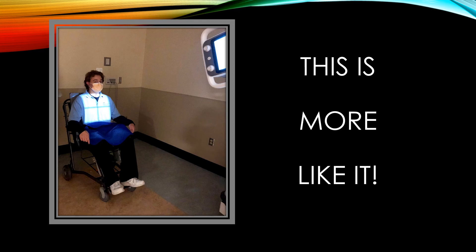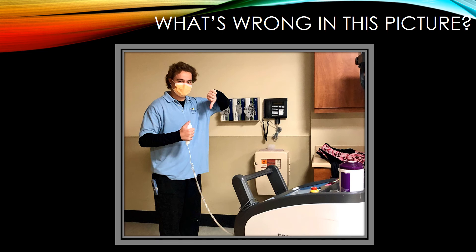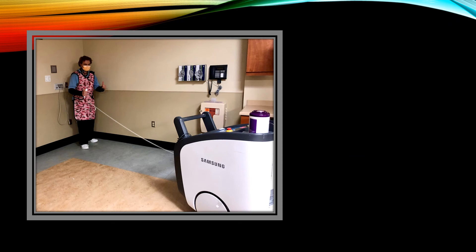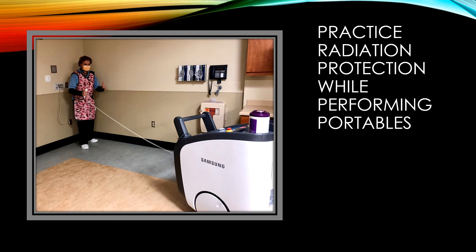What is wrong in this picture? The technologist is too close to the portable machine — he has not stepped back to six feet, and he is also not wearing lead. The correct approach: practice radiation protection while performing portables. Step back six feet at least, wear your lead, and practice time, distance, and shielding.